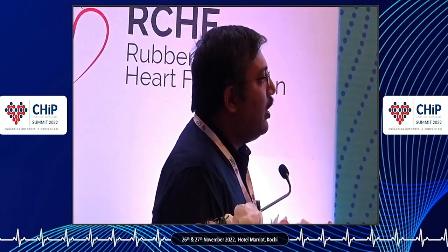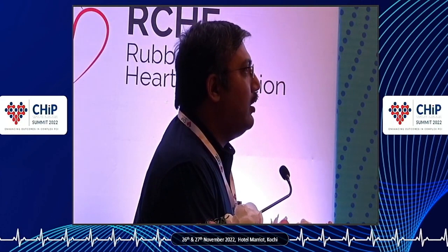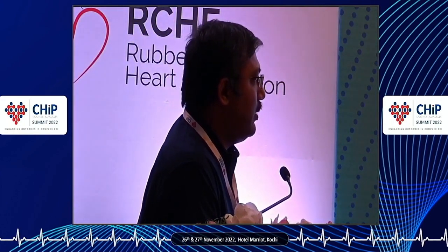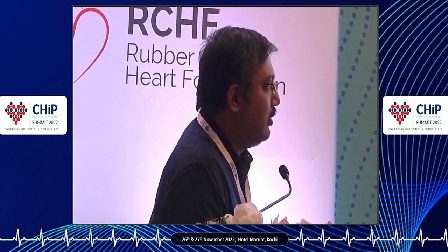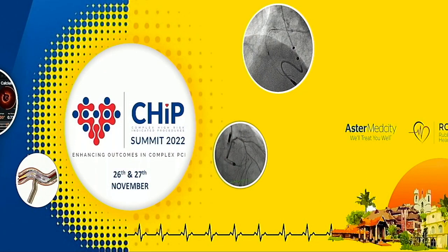I think most of the things are, one is we have for Guidezilla, you have 6 French available very commonly. Guideliner 6 French, I'm not very sure whether it's available with us. We have 5 French, and ST5 also 5 French. On the same topic, most of the industry that makes those 6, 7, 8 French, they're much the same. I usually alternate them all the time. Of course, Teleflex has a 5.5 and more importantly 5 French. Quite commonly, if you do 5 French intervention or even 6, 7 intervention, this 5 can deliver things more distally. And through the same 5 French, you can do small cutting balloons, small OPNs.